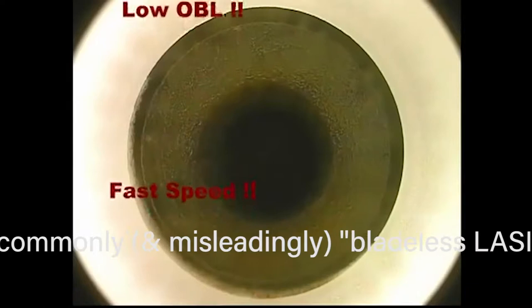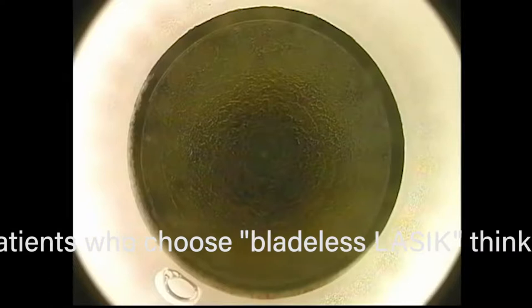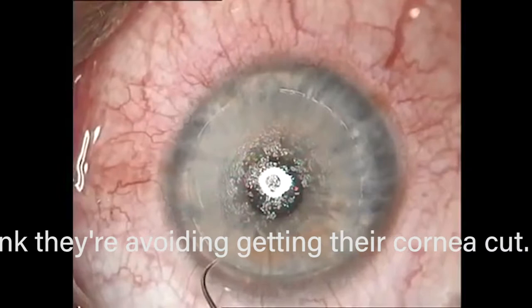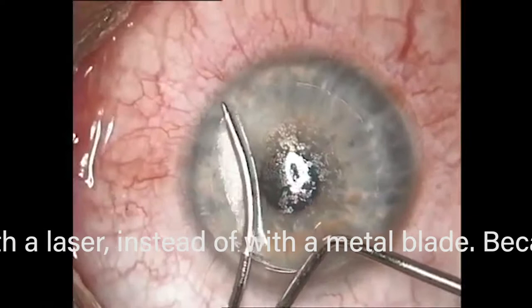This manufacturer is advertising that it's a fast speed. There are some problems you can get. You can see it's trying to make two patterns to get them all contiguous so you can lift it up. Sometimes you can see it's not a fully dissected flap — this is a blunt tool the surgeon uses to dissect. Sometimes you can't make the dissection because some of it's hung up or not cut. But this one's fine because this is a demo tape, so it's going to be a perfect case.